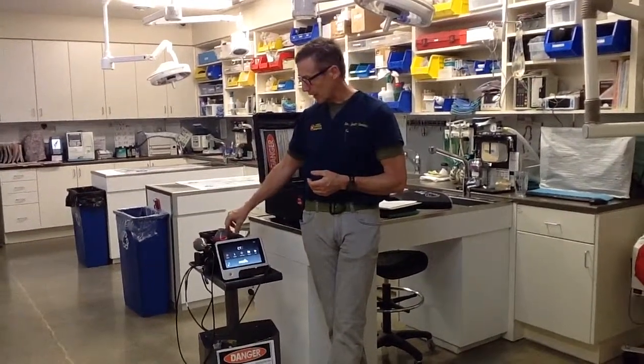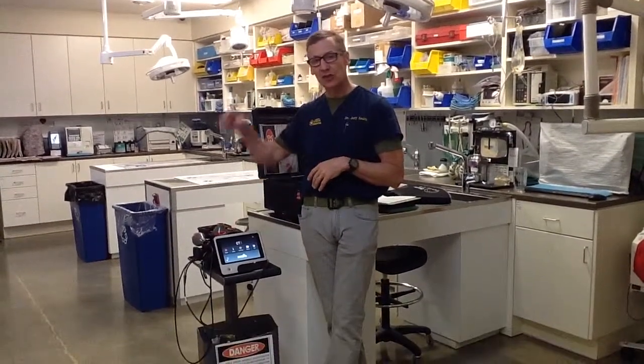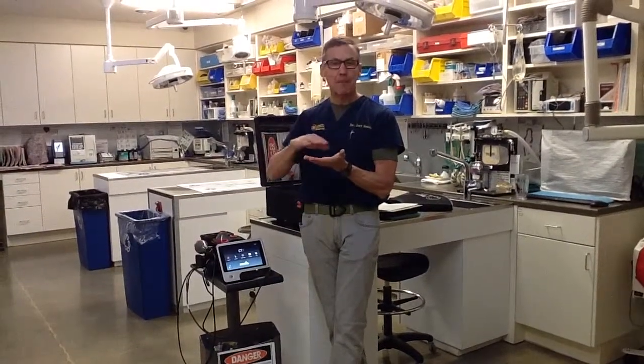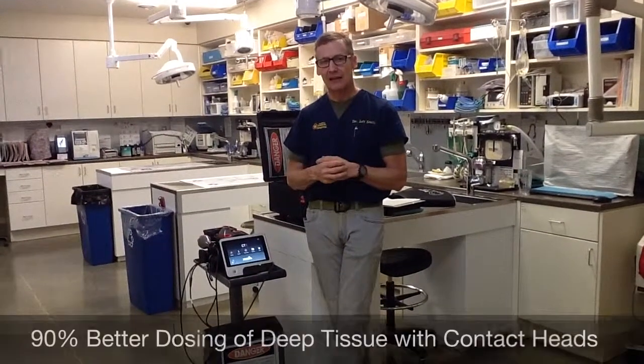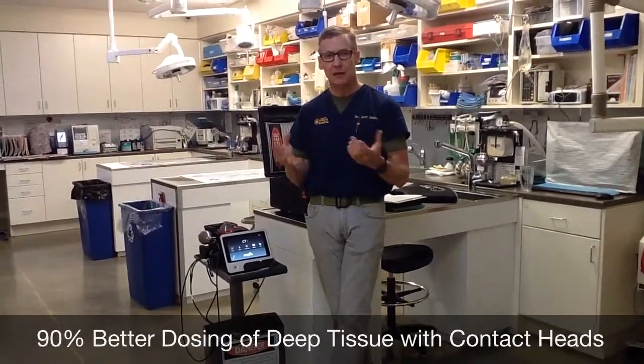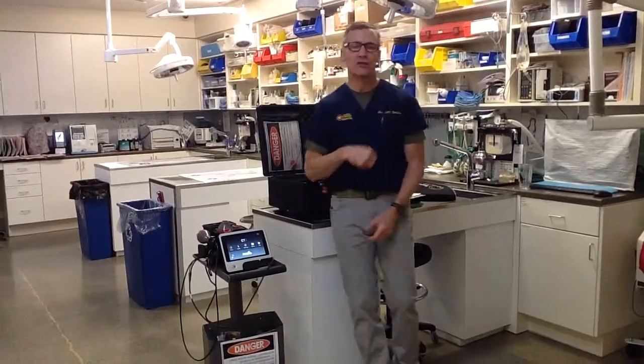The laser will give you a warning anytime you're over three watts to check the appropriate head size. Which head do you use? If you can't see the pathology and need to get light into the tissue, you want a contact head — ninety percent better dosing of deep tissue with a contact head than with a non-contact head. If you can see the lesion, use the non-contact head: hot spots, otitis, stomatitis, surgical incisions.